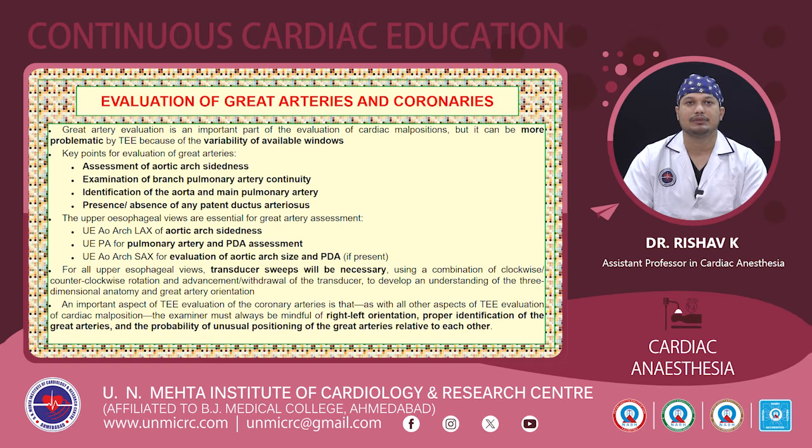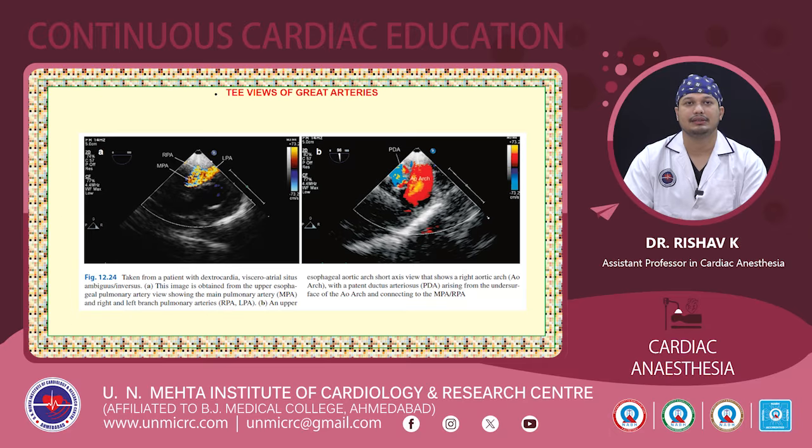An important aspect of the TE evaluation, the coronary arteries, is that as with all other aspects, we have to be mindful of the right-left orientation, proper identification of the great arteries and the probability of unusual positioning of the great arteries relative to each other. Now, these are some of the TE views showing the great arteries. Firstly, the upper esophageal pulmonary artery view, showing the main pulmonary artery bifurcating into the LPA, that is the left pulmonary artery, and the right pulmonary artery.